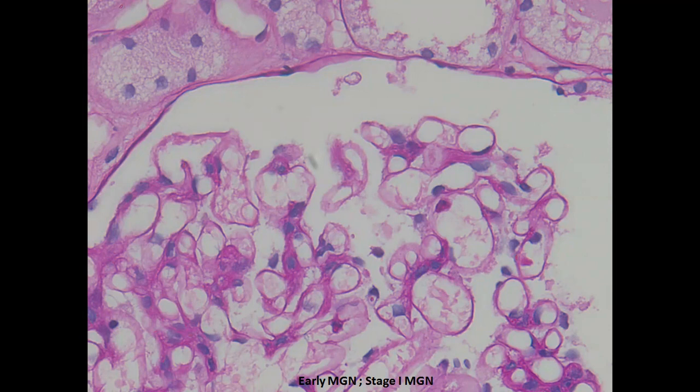If you are not doing immunofluorescence, you are going to label this as minimal change disease, because membranous glomerulonephritis in early stage, or stage 1, will look just like a minimal change disease glomerulus. The morphology will be absolutely normal. The only unusual finding is a patent or dilated capillary lumen, which can happen even in MCD. Occasionally, because there are subepithelial deposits, on routine light microscopy you can also see some prominence of podocytes.